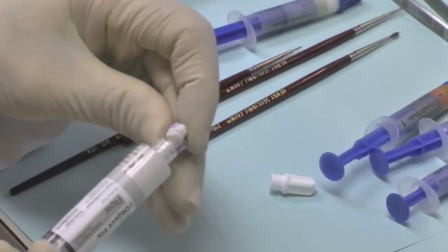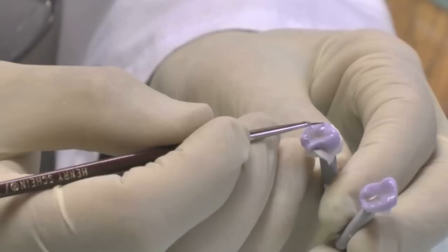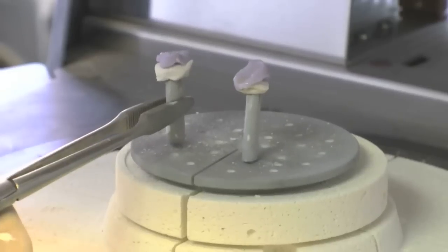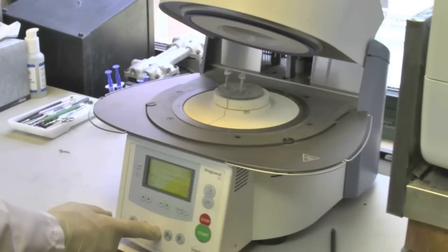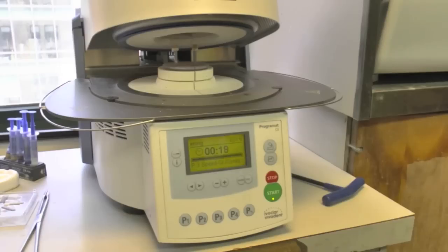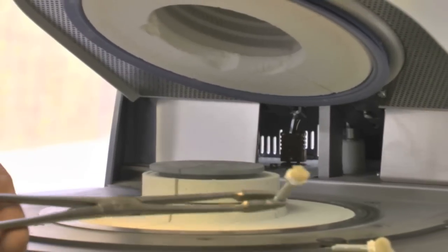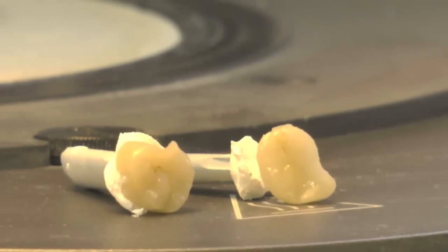All we need to do is add some characterization to the restoration and spray on some glaze and place it in the oven, which is automated and easy to use. When they come out of the oven, we have lifelike translucent restorations that are ready to insert, and really beautiful.